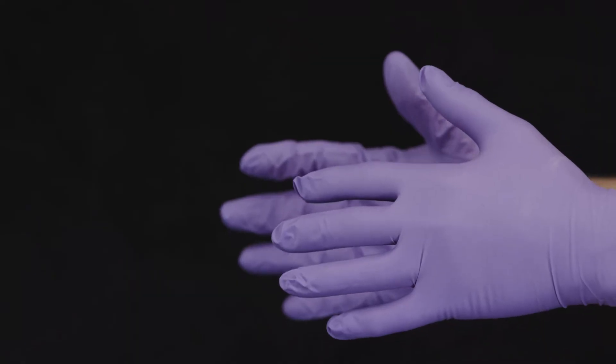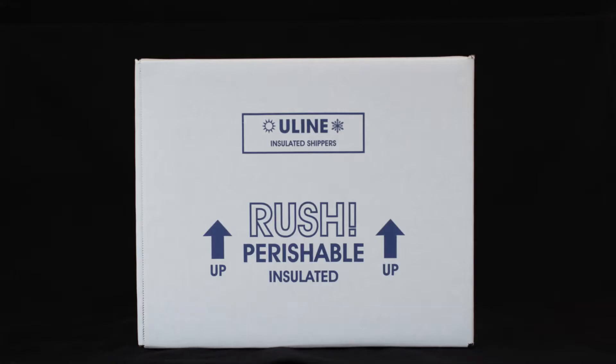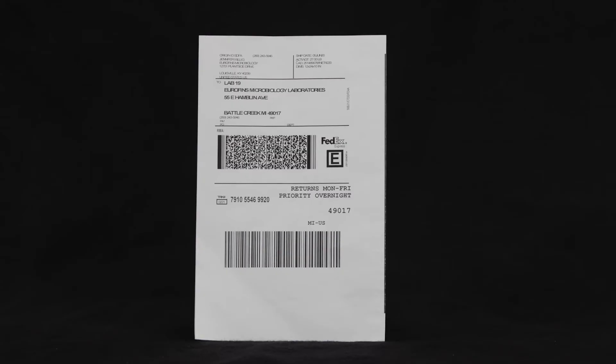Also included are disposable gloves, gel packs to keep samples cold when returned to the lab for testing, a return shipping container, and a next day air shipping label for return to our Coronavirus Environmental Testing Center of Excellence.